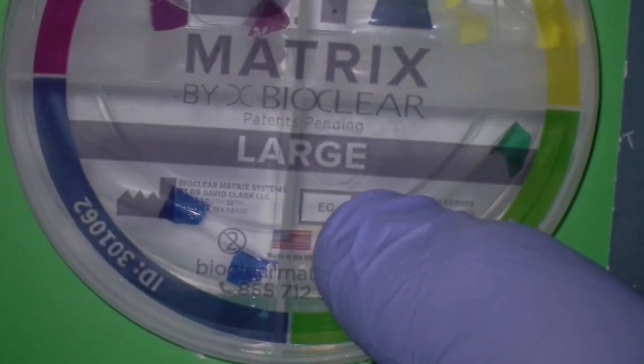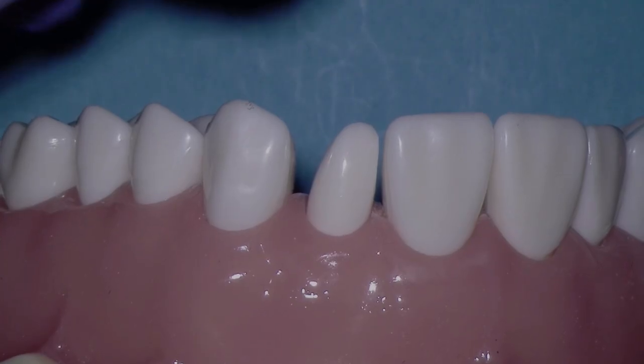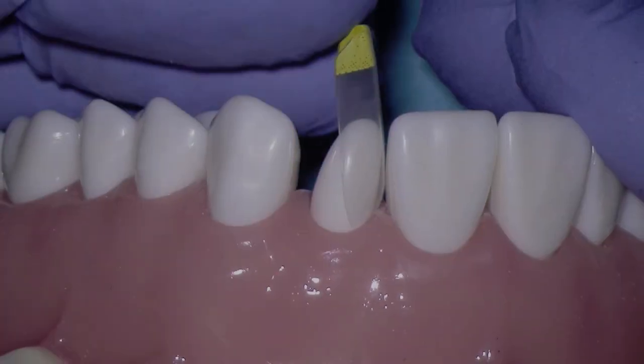And now I'm going to get into the large tub of matrices. And in that tub, I'll be using the matrix with the green emergence profile. The green has a little bit more emergence profile than the yellow. So now I'm going to go ahead and try in the matrix for the mesial.